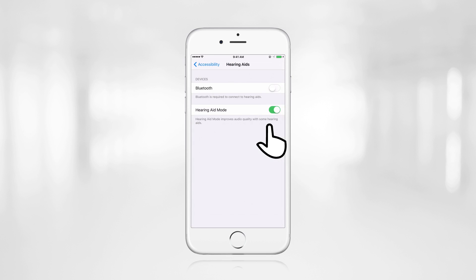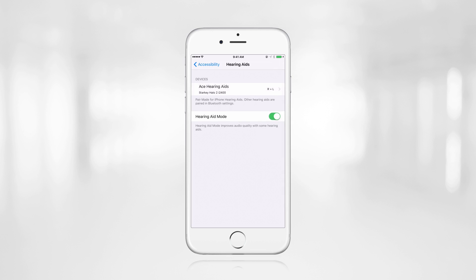If Bluetooth is not turned on, turn it on from this screen. The iPhone will begin searching for the Halo devices. Once the hearing aids have been discovered, they will display on the iPhone screen.